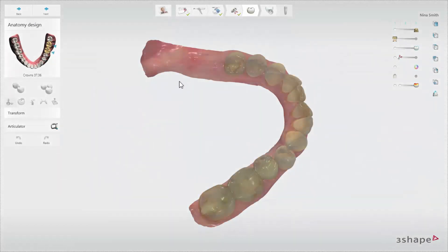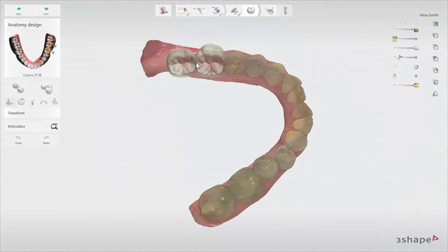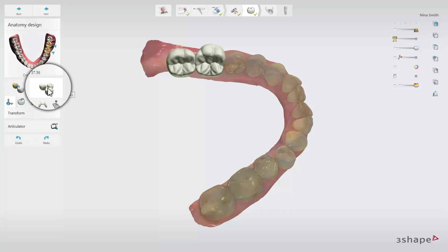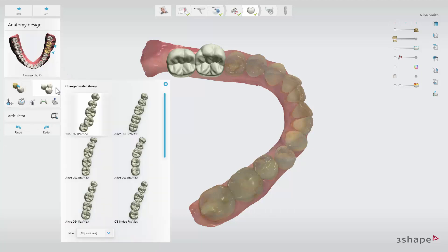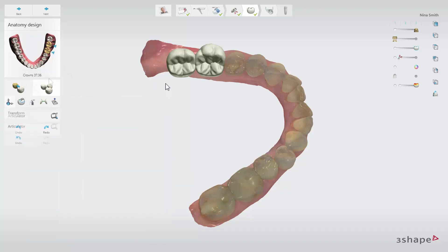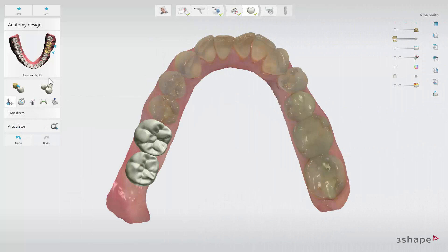The Anatomy Design step allows you to design virtual crowns, which can be helpful in order to drive the implant treatment planning prosthetically. Click the Choose Smile Library icon to select the desired tooth anatomy and place it on the surface scan. To change the shape of the crown, you can select another library. You can also choose to copy a tooth if the existing anatomy is suitable.